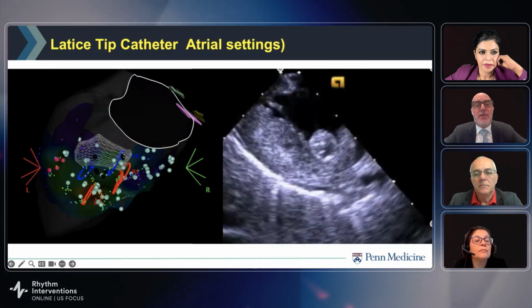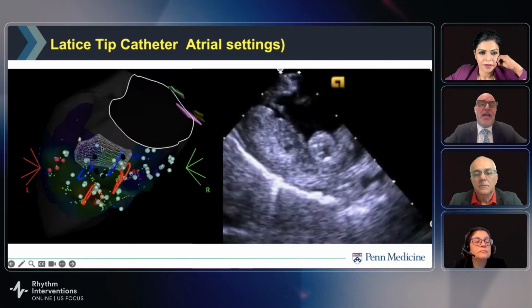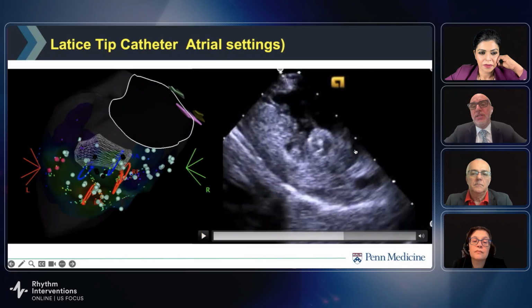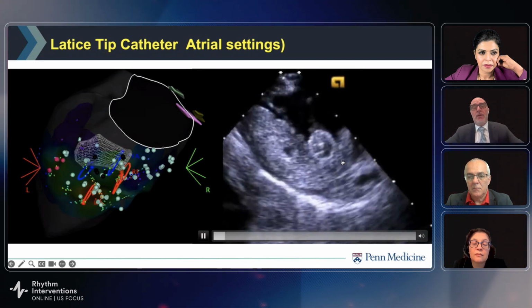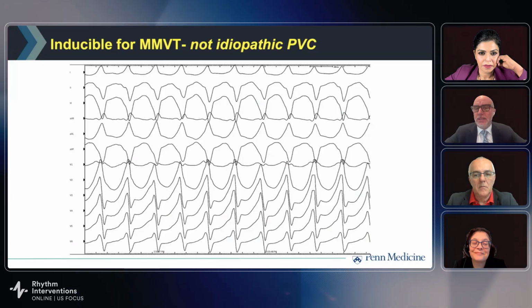And this is the representation of that area of scar, which we designed as a separate structure. What is very nice here, as you can see, is the catheter contact. And what you're seeing is a catheter going into some sort of cavity and a thinner muscle, and you're trying to access it. Well, unfortunately, we had PVC recurrence at the end.